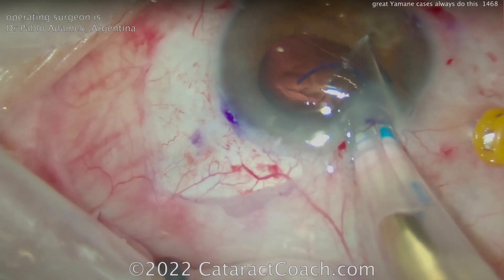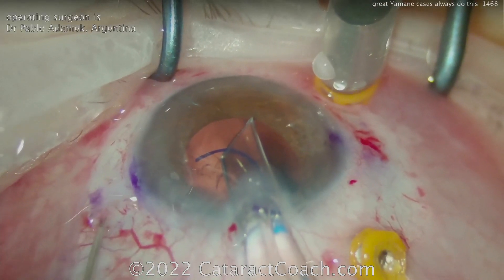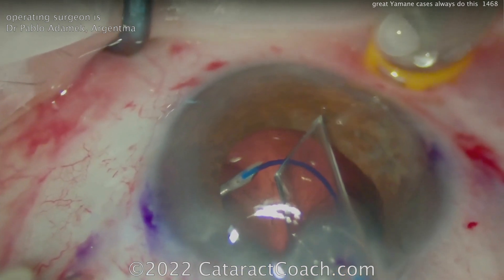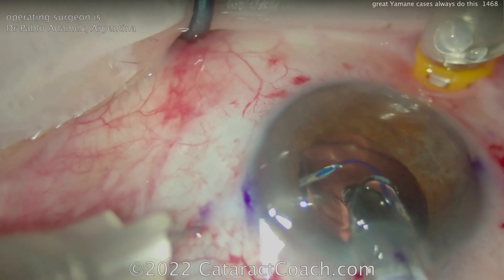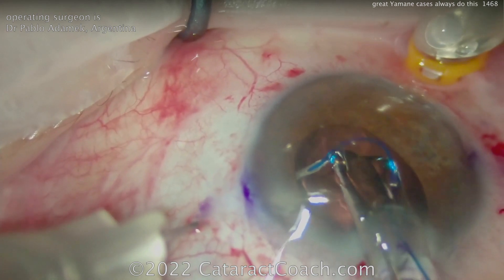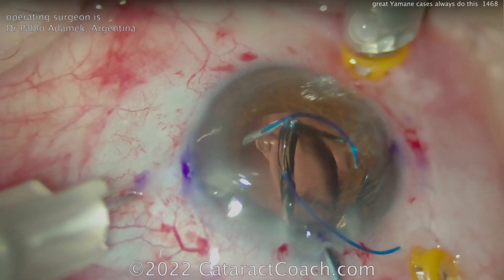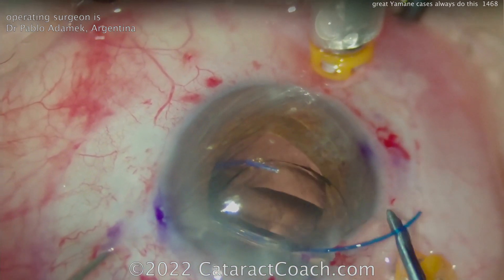Delivering it in the eye nice and slowly. There have been studies showing that patients who had cataract surgery by an anterior segment surgeon and then needed a Yamane — if you only did a partial anterior vitrectomy before the Yamane technique, patients more frequently had macular edema and traction on the vitreous. That's because you entangle the haptic and optic within the vitreous. So I really do encourage you: if you're going to do a lot of these procedures, you need to be able to do a thorough pars plana vitrectomy to avoid that issue.